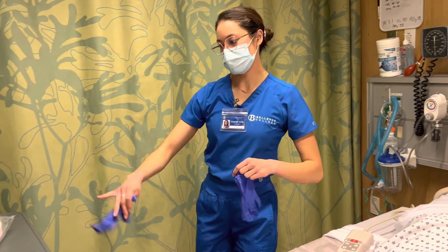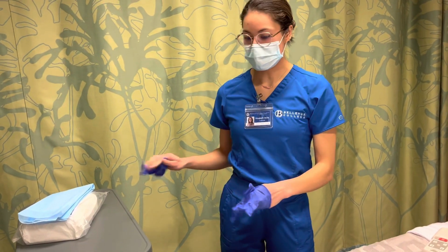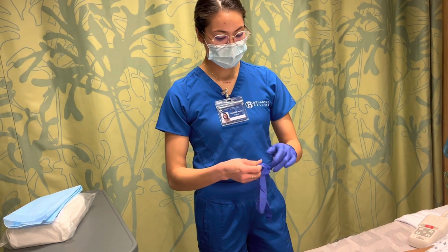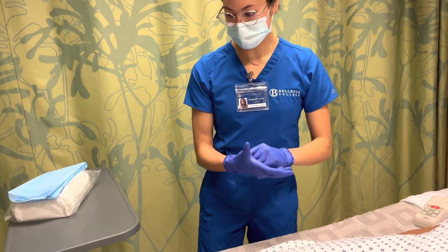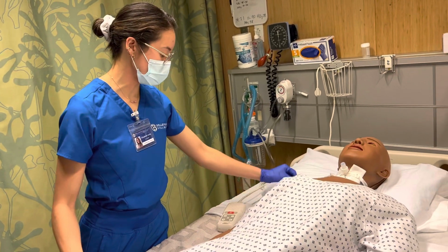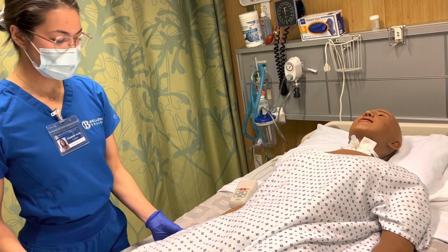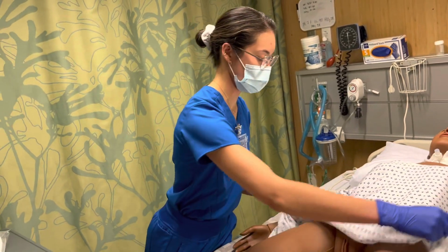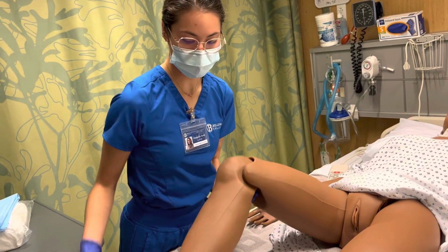And I would have wiped down my surface, let it dry completely so that I had a clean surface for my sterile field. Alright, so I'm putting some clean gloves on and we'll position our patient. So I'm going to expose you now, okay, and position you so that you're ready for the insertion, okay? Just let me know if you're feeling any discomfort. We'll keep you covered up as much as possible. Bend your knees.